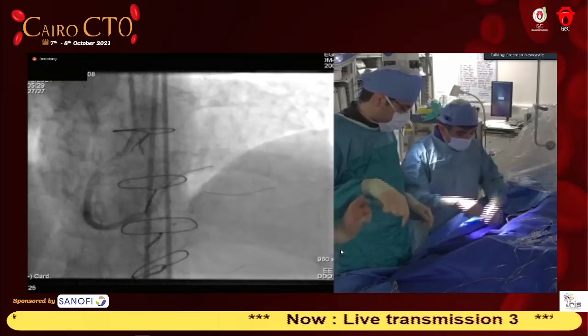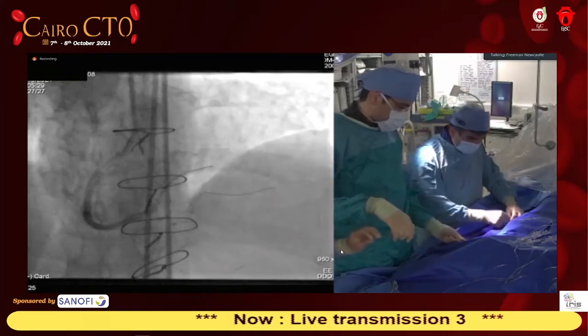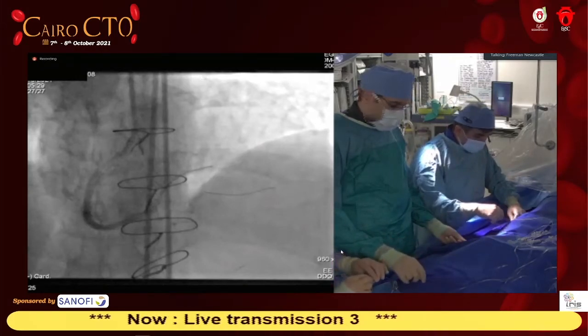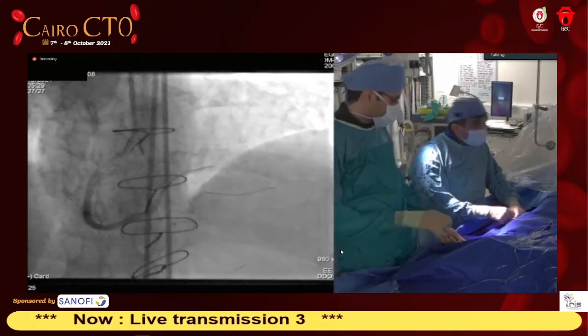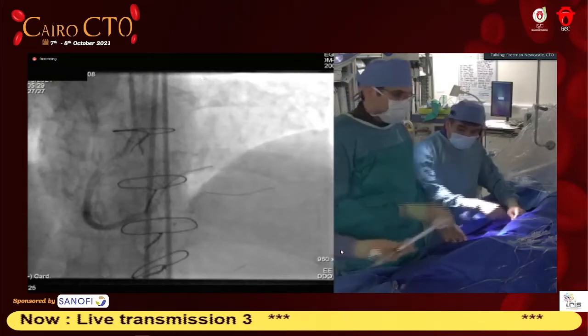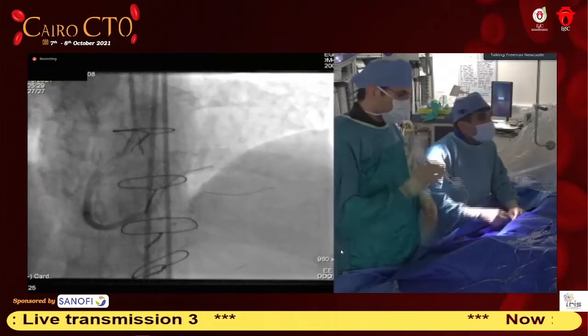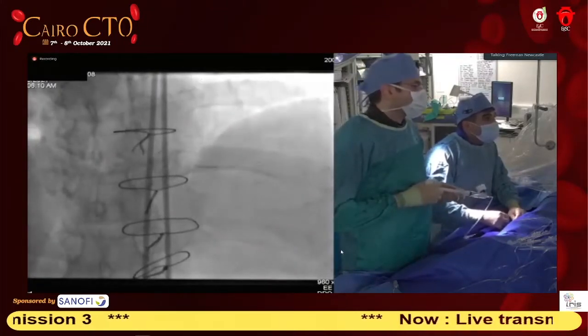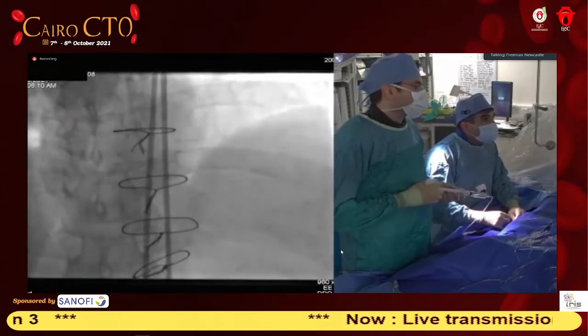Yeah, but I'm hoping that we'll get rid of the vein graft so there's no competitive flow. And I will not do this until I'm sure the antegrade flow and the artery is well sorted and well treated. So there's a TIMI-3 flow and everything is just perfectly poised. So here we go. Taking the balloon and I'm going to dilate around the bend.